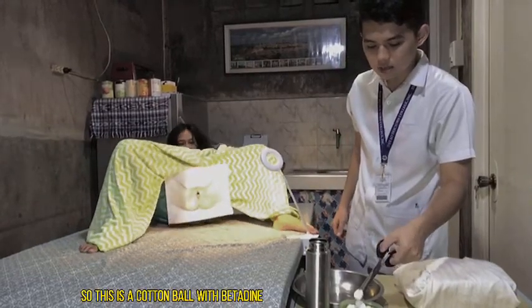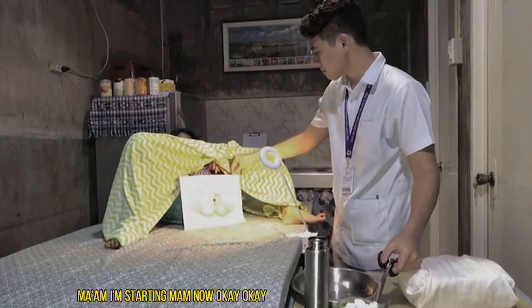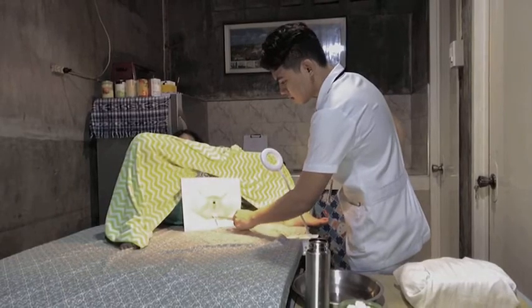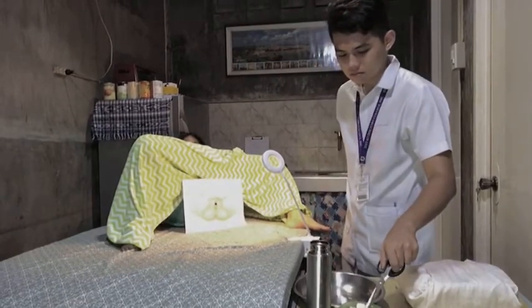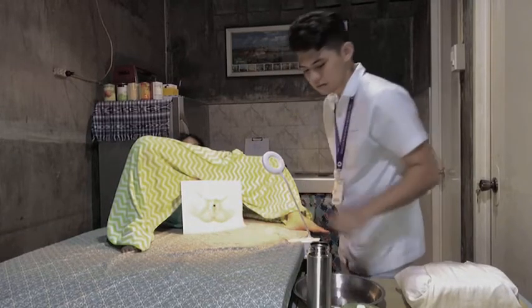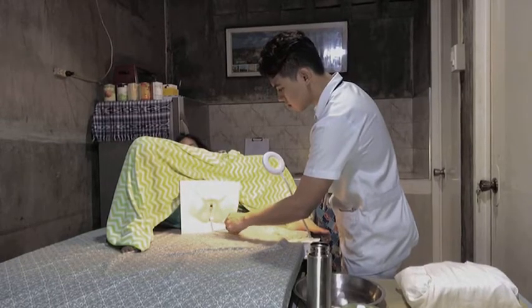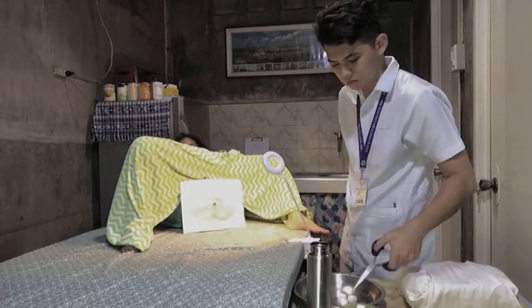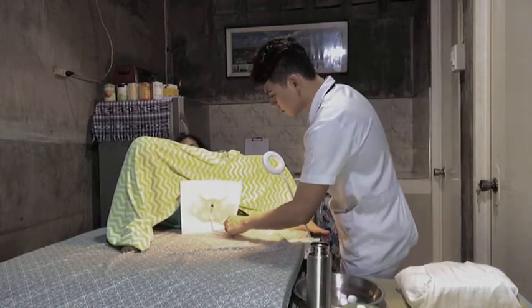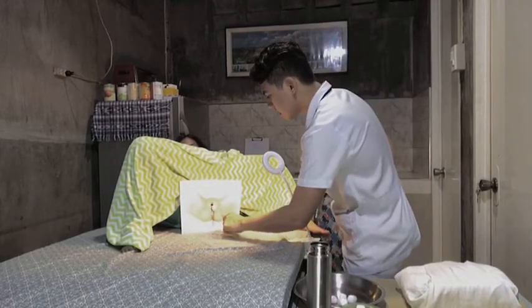So this is a cotton ball with betadine. Okay, ma'am, I'm starting now, okay? This is with betadine. Lastly.